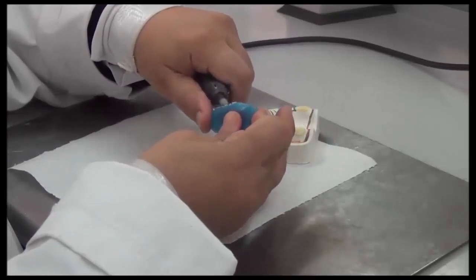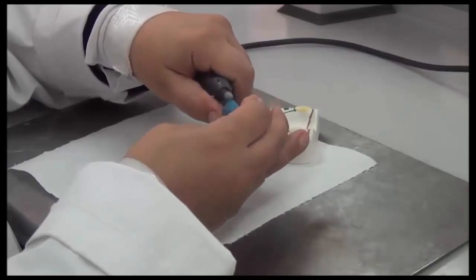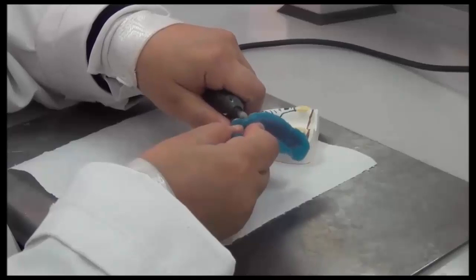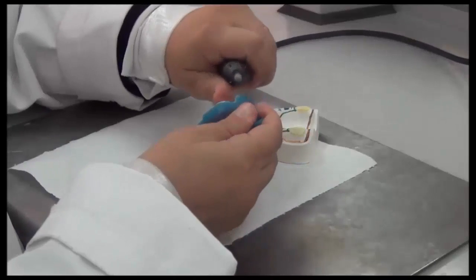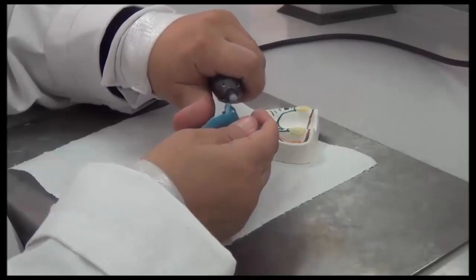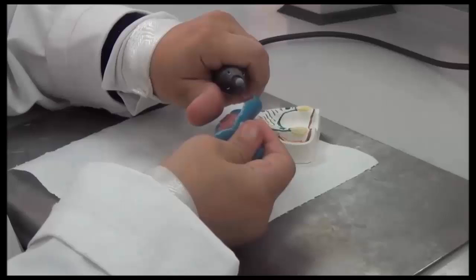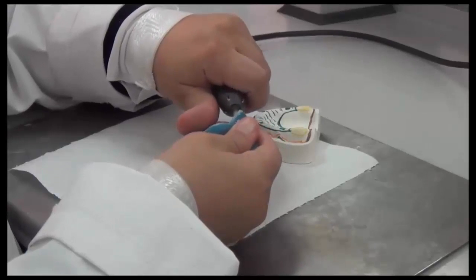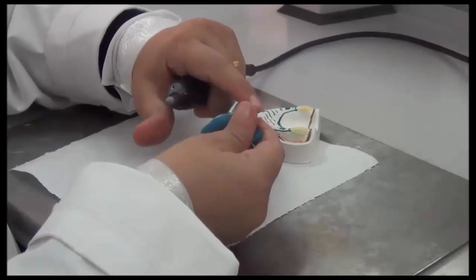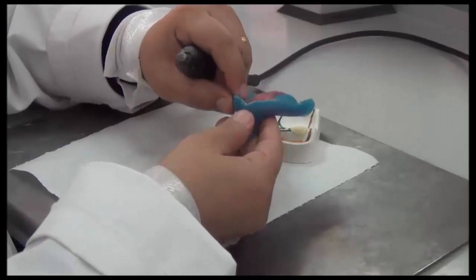Further smoothing the surface, going around the border from the upper side, going into this notch and smoothing it, and making sure that all of the edges are not sharp. You can see my finger rest at all times. I'm holding the tray firmly. I'm just running over the border to remove sharp areas, and you can notice from the light color produced that these are now smooth. So it becomes an area rather than a sharp edge.